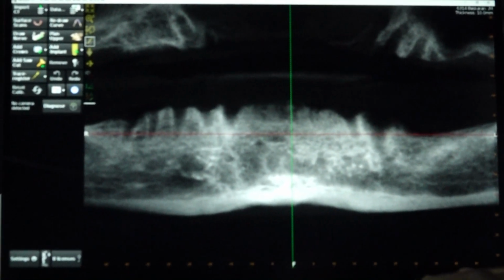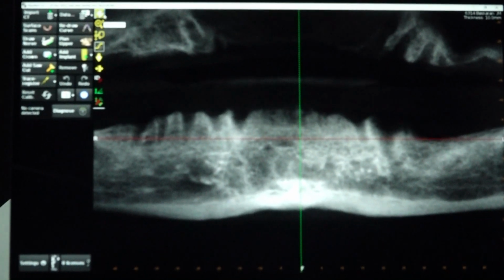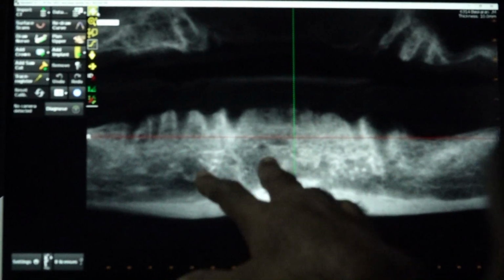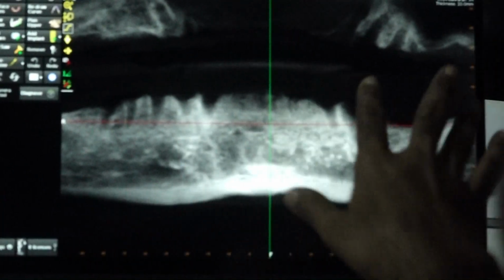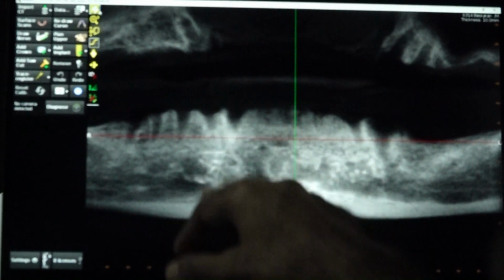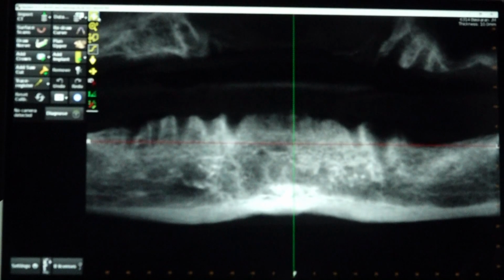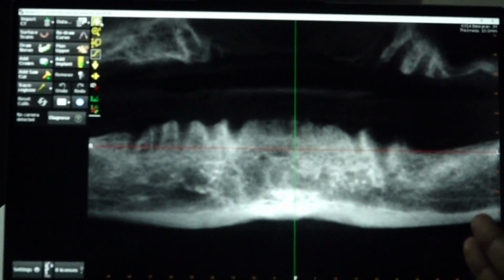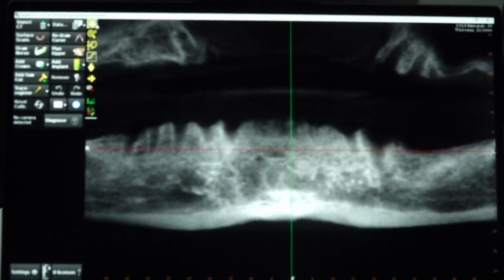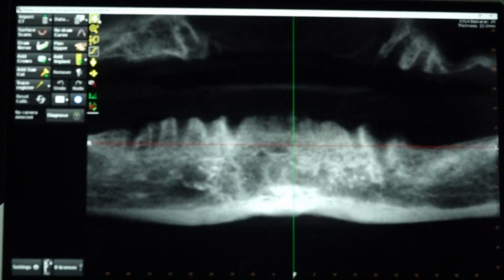Coming to the 6 implant plan. If you are planning for the 6 implant plan, I told you anteriorly 4, distally 1 more on each side. Those 4 implants you can place all straight, or you can place them like all-on-4 tilted style, where you place the tilted implant just anterior to the mental nerve exit on each side and 2 axial implants.